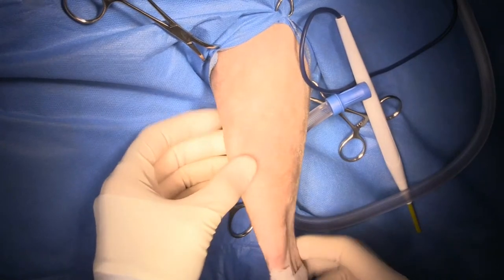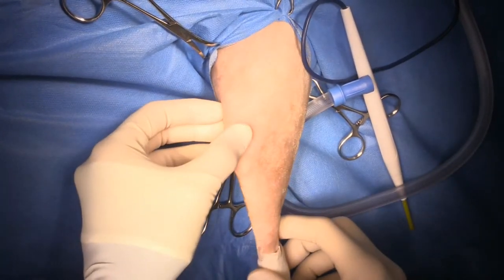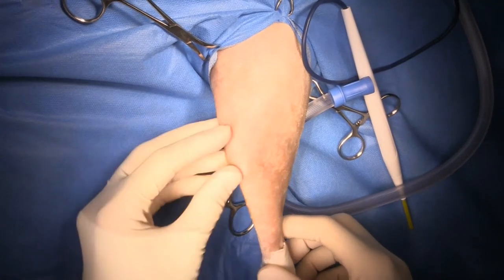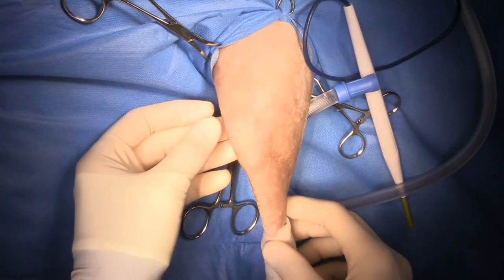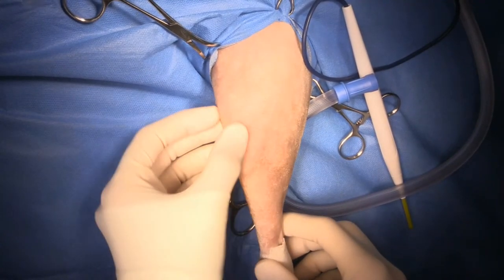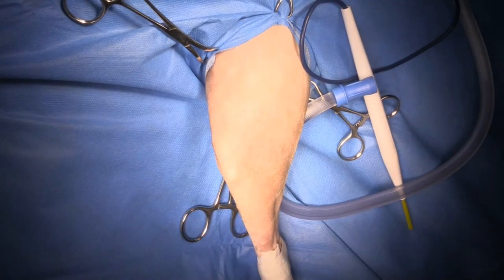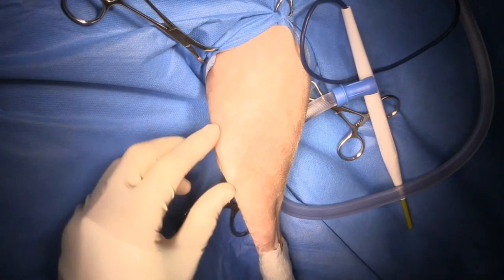This is a one-year-old poodle with a history of intermittent left hind limb lameness. You can see the patella sitting there - now it's luxated, now it's back in, so you can see that it's popping in and out easily. The opposite side will also luxate but it's not showing any clinical signs of lameness.